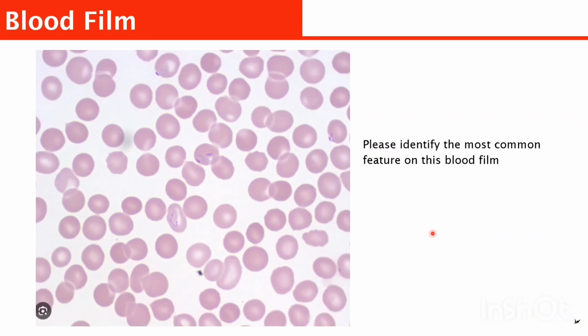Do you understand me? Okay. Now, that means you are identifying that there are no white blood cells, so leukopenia. That's severe leukopenia. Okay. Severe leukopenia. That is very important. Now that you've said this, another type of the blood cells we can look at is something like platelet. Can you see any platelet here? I can't see any. There is no platelet here, in my own opinion. And because of, again, the absence of the platelet, we can say that this is thrombocytopenia, severe thrombocytopenia.